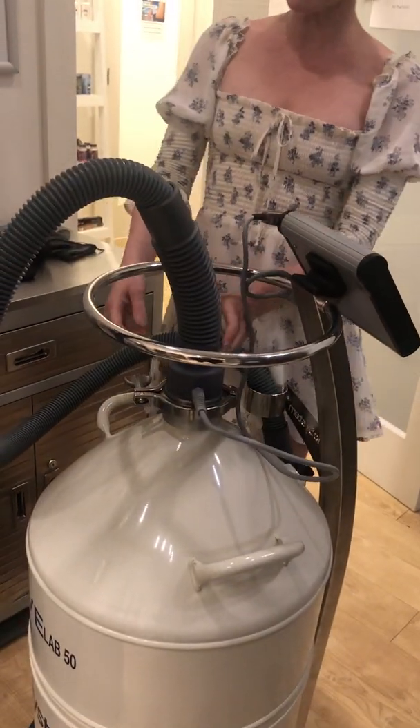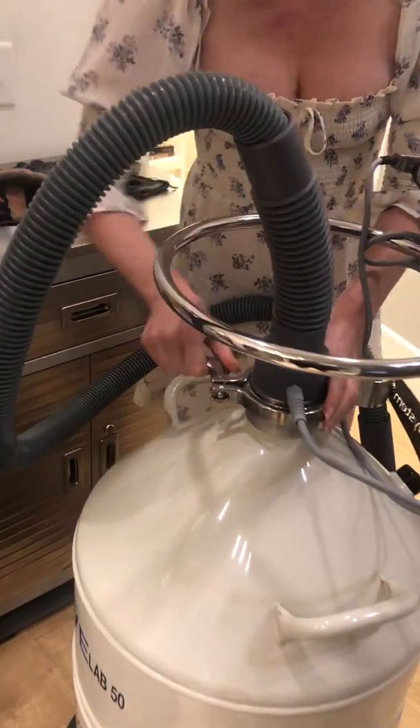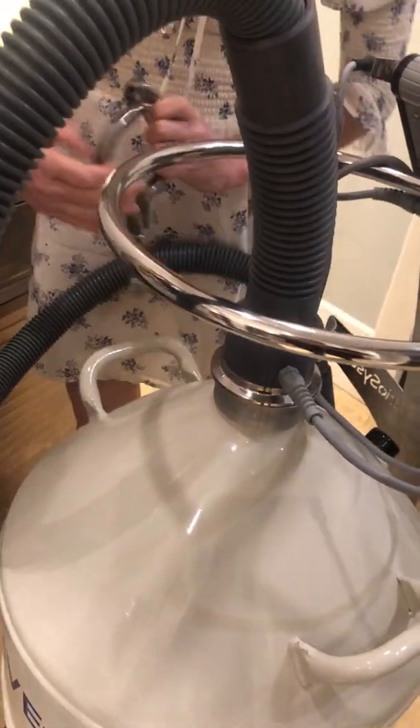Hi! I'm just going to show you guys how we fill the local cryotherapy machine because it's pretty exciting. First, we undo the clamp that holds the hose tightly around the neck of the liquid nitrogen dewar.